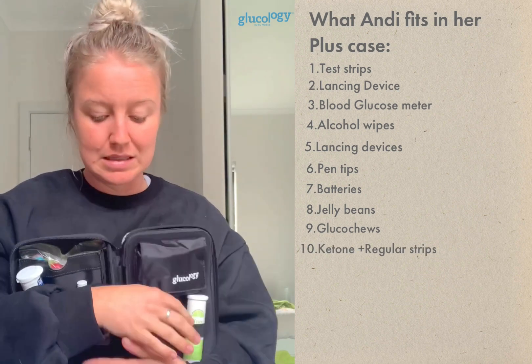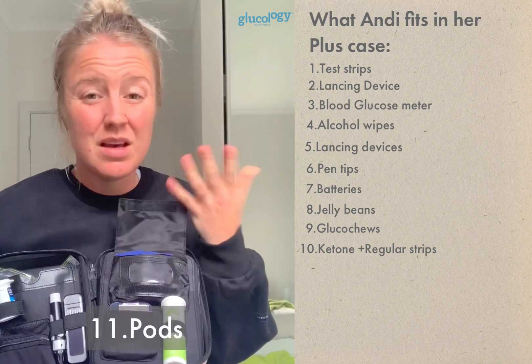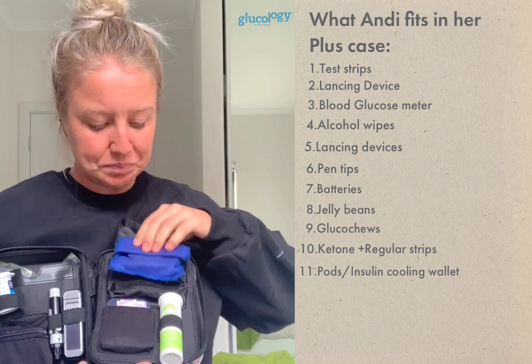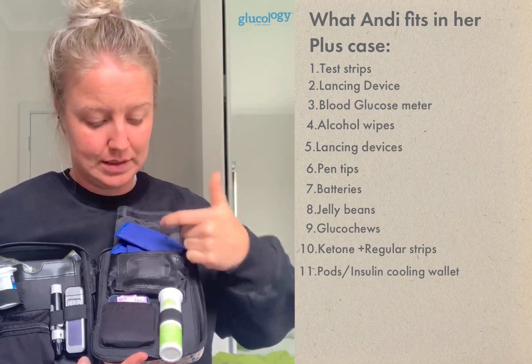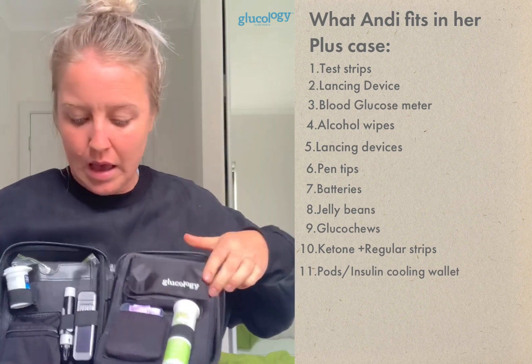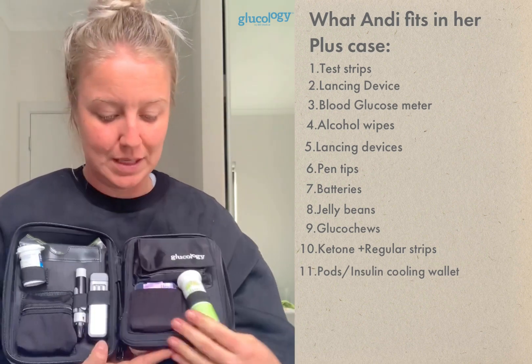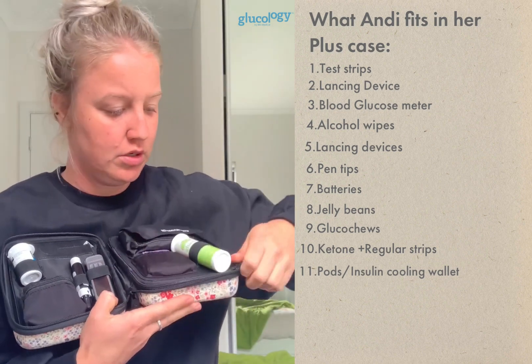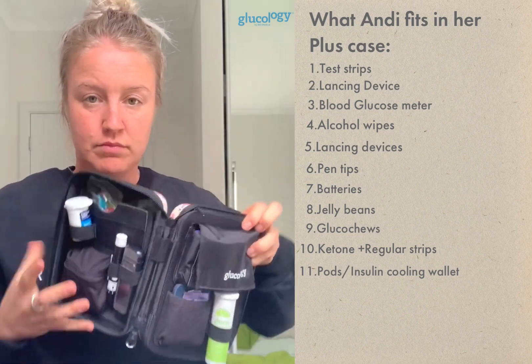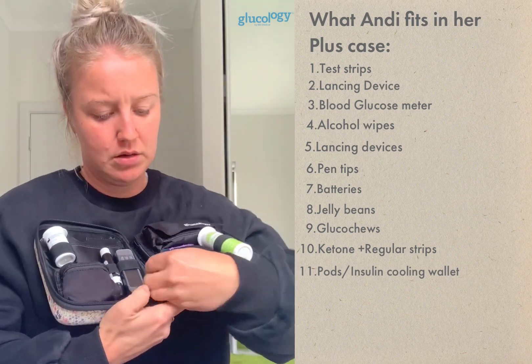I keep a spare meter with ketone strips and regular strips in case my main meter stops working. In the main compartment I currently keep my insulin cooling wallet with my insulin inside — that's also IBD Medical. The travel case plus has a whole extra zip pocket that folds down into a back section; you don't have to use it, but it stays neatly in place when not needed.